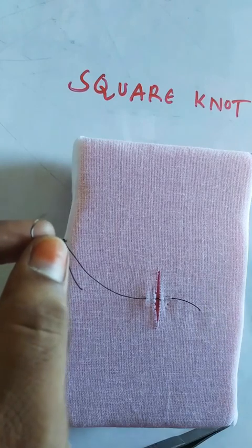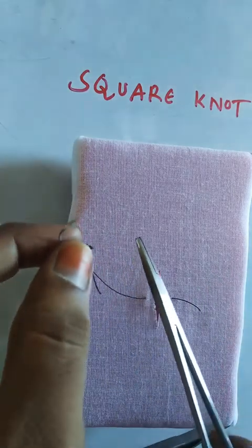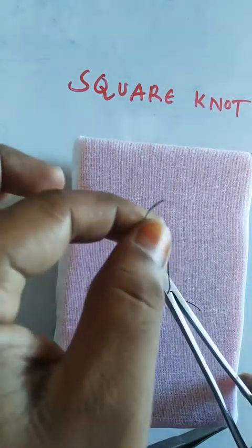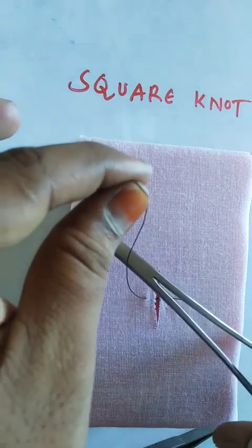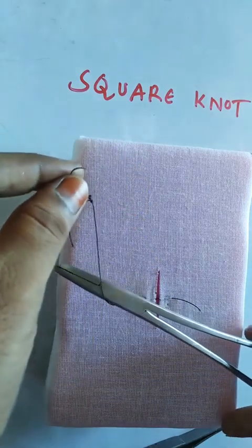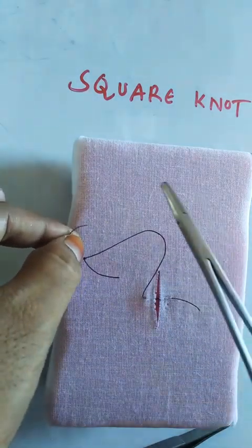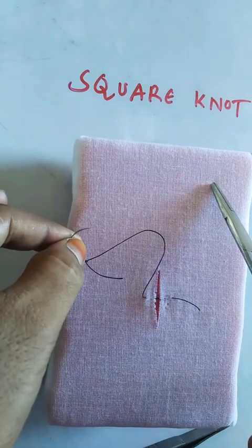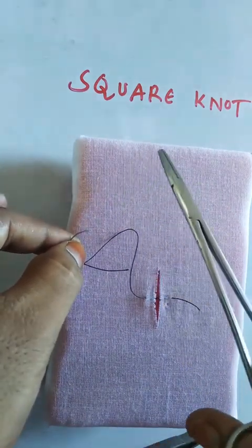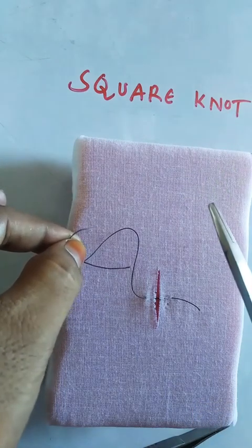In a square knot, one throw of the long end should be passed around and over the needle holder in clockwise direction. You got it? Clockwise direction is in this direction. Anti-clockwise direction is this direction. So the first tie should be made in clockwise direction.